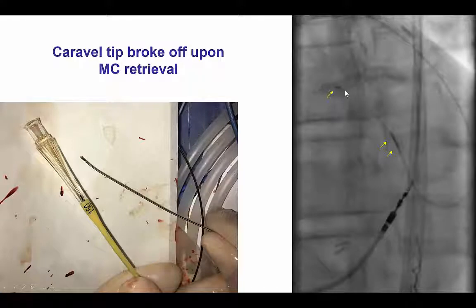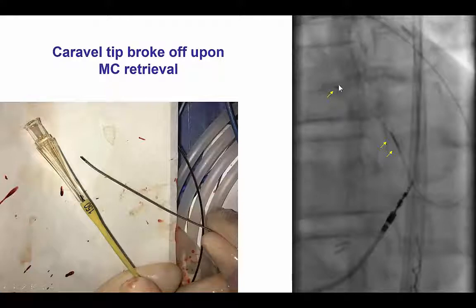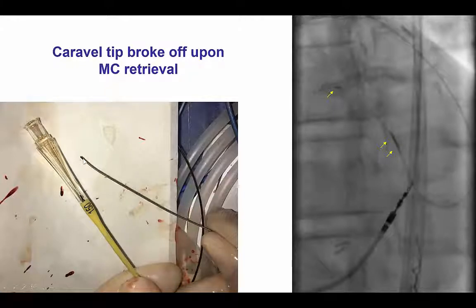We eventually tried to remove the Caravel to replace it with another microcatheter. In the process, the Caravel microcatheter tip broke and remained entangled into the left main stent, while the back end of the Caravel came out.